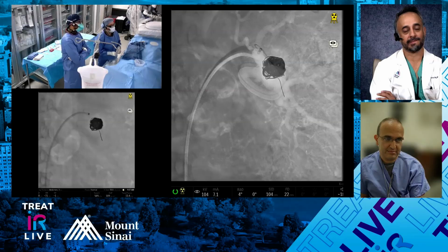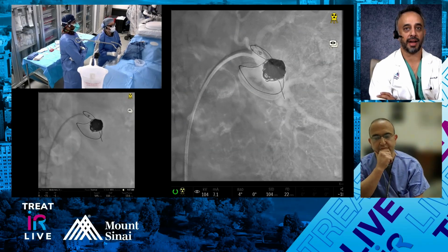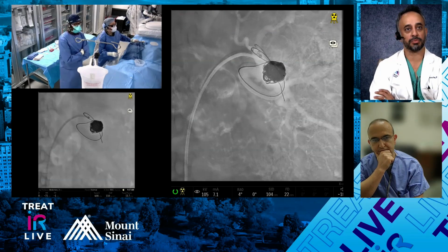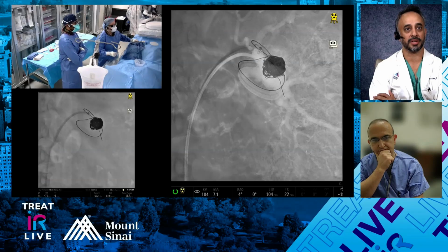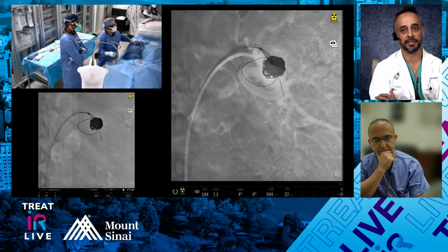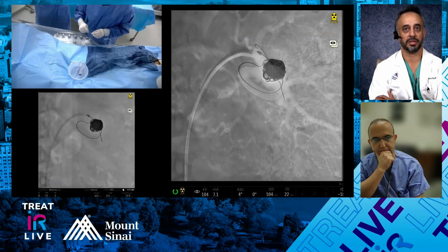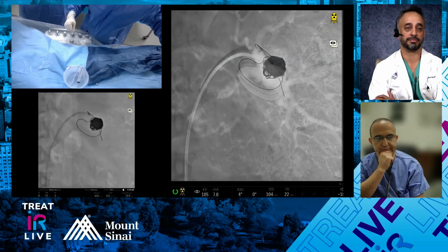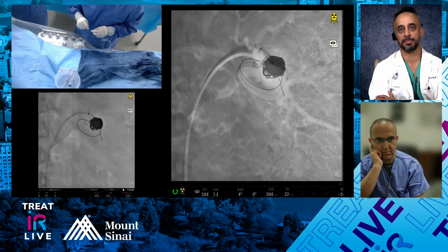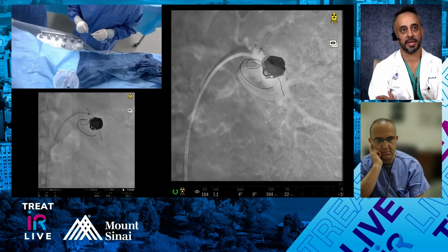Does it depend? Look, I think for giant aneurysms like that, if I can get an 035 catheter out, I would prefer to start using 035 coils just from a time perspective. The problem is the biggest 035, at least that we have, is 20 millimeters, the secondary loop. Usually it's not a big deal because the outflow vessels themselves aren't that big, so you can get away with it. We have 035 interlocks, and that'll work. I know Penumbra has their new 035 coils, which I think go up a bit bigger, but I haven't used them, so I don't know how they behave.